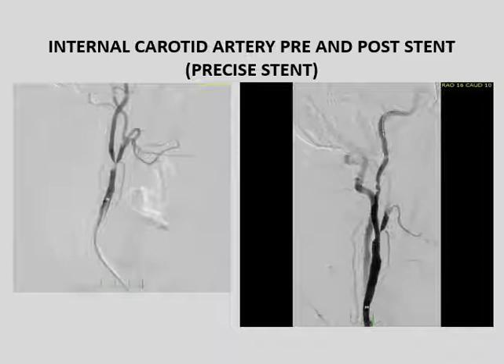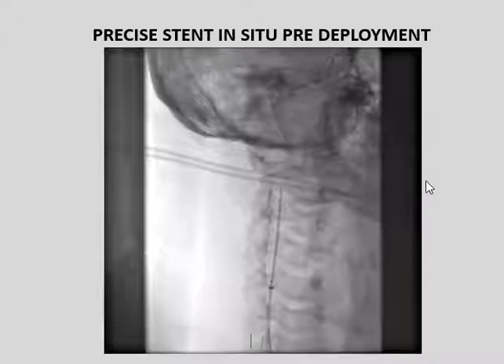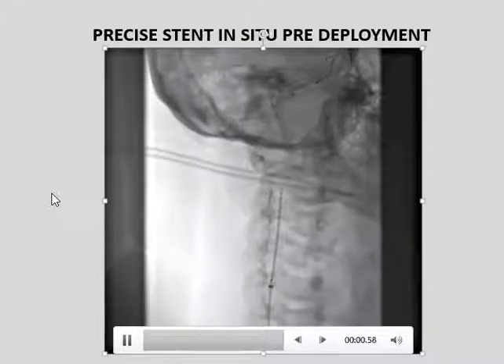However, there is always a risk of dislodging an embolic particle that could infarct on the brain. To prevent that, we use what's called a distal protection device, but this slide shows you how that self-expanding stent is deployed. The actual process of deployment takes too long to record on these slides. The memory would be far too intense, but you can see how carefully the device is positioned, comparing this image to a roadmap image that they would have.